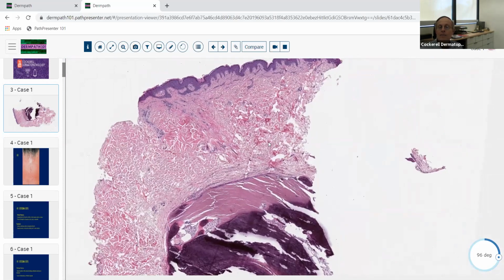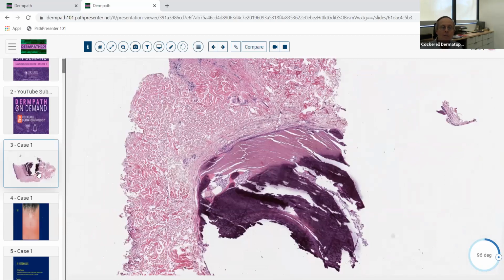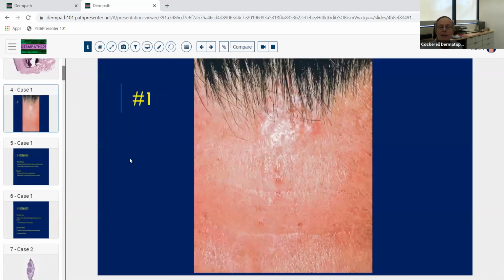It's also called matrical cyst with calcifications. There are a number of different names that have been applied to this. Clinically, you know what a pilomatricoma looks like. These look kind of bluish, a little cyst-like lesion in the skin. They're often thought to be pilar cysts or other things like that. But osteoma cutis looks like a little, almost purplish lesion in the skin, and if you biopsy them, they feel really gritty.